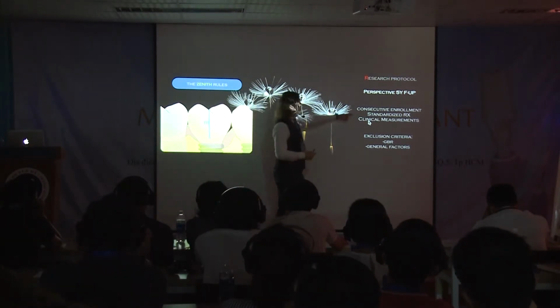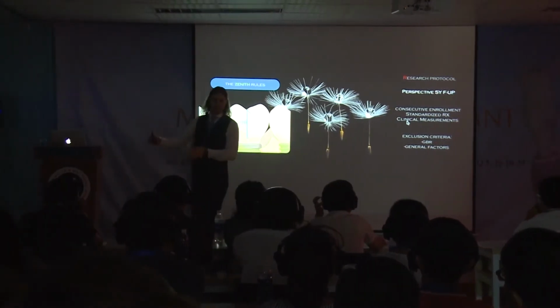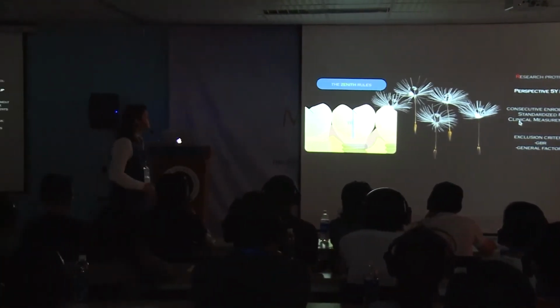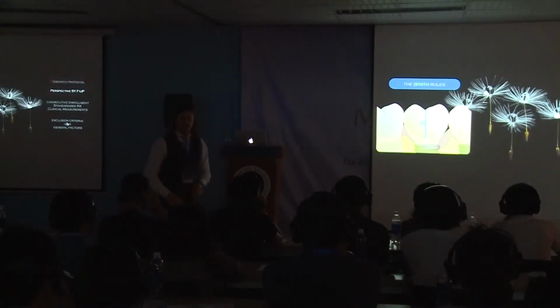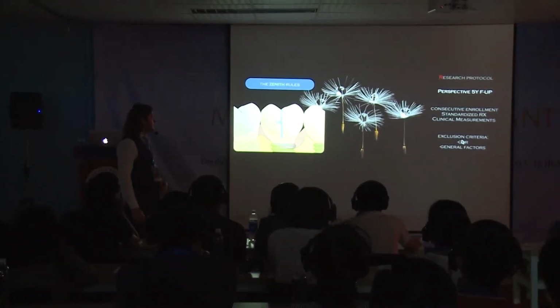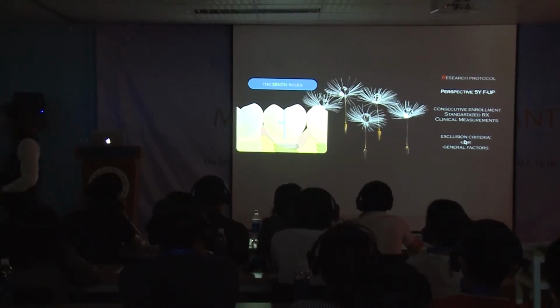So a silicone stent kept the radiograph in the same position at any control. Exclusion criteria are any bone regeneration sites and general factors that prevent placing implants, of course.